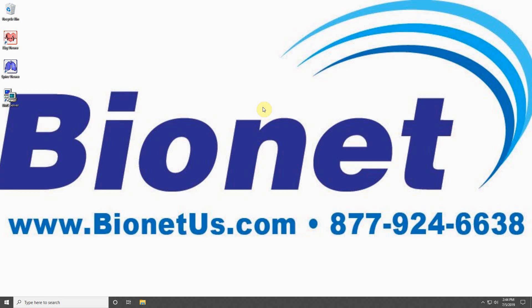To begin understanding how to use BMS Plus, let's start with the BMS Server program. This program is designed to work in the background and receive data from your connected ECG or spirometry machine.